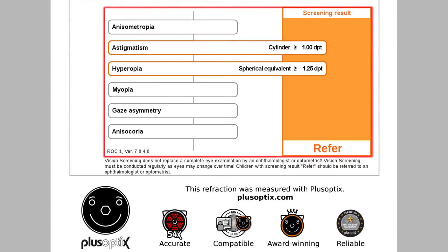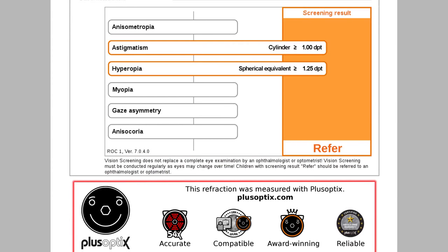An evaluation as well as a screening result is displayed below the measurement values. The lower side of the page allows for a customized info column to be shown. Instructions for designing a customized info column can be found in the user manual.